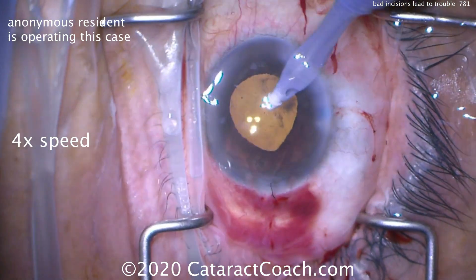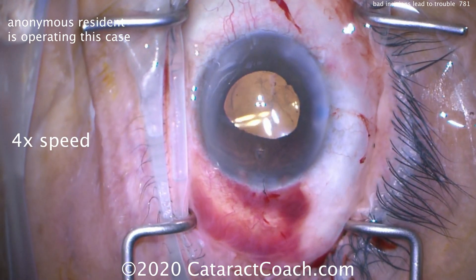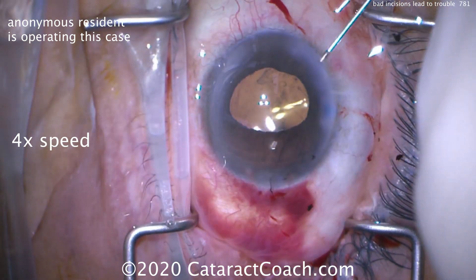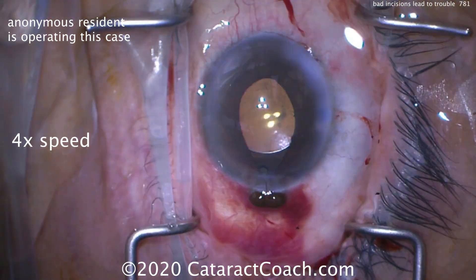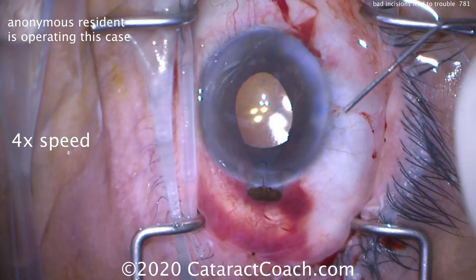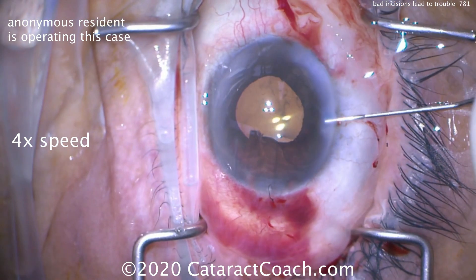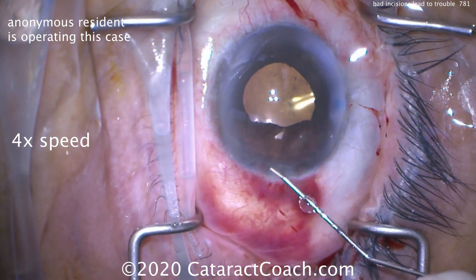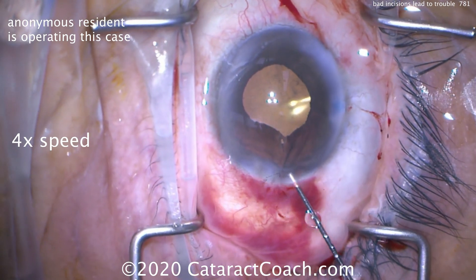Here's the end of the case. The IOL goes in the capsular bag. Viscoelastic is removed with the IA probe, and the incision can be sealed up. Now look — even more iris prolapse. This eye is prolapsing in. You can't overly pressurize this eye. Go back in the eye and sweep the iris back into position. Make sure the incisions are hydrated and sealed.